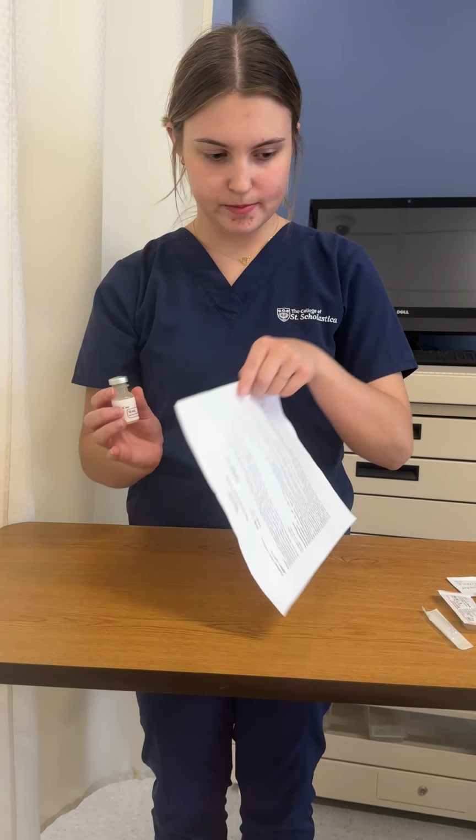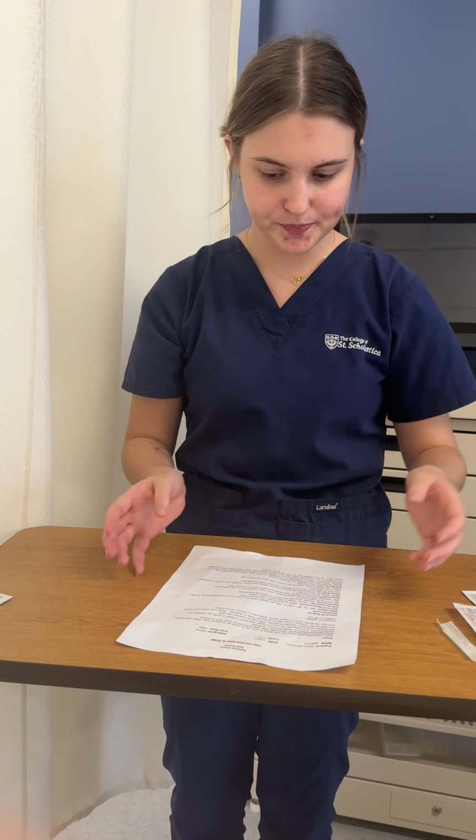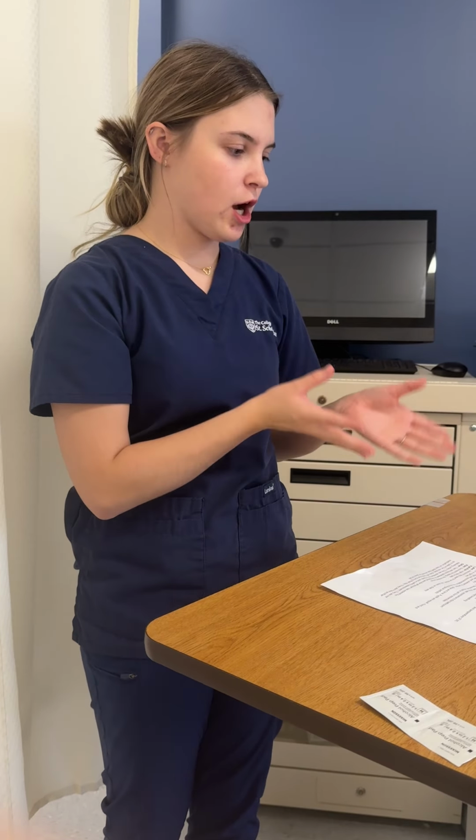So looking at this package, it's not cracked, it doesn't seem to be contaminated, the lid's still on, it's not cloudy, and it's not expired. This one isn't expired, it's not cracked, cloudy, and the lid is still on as well. Okay, so now we're going to draw up our medication, so I'm gonna come over and grab a pair of gloves.